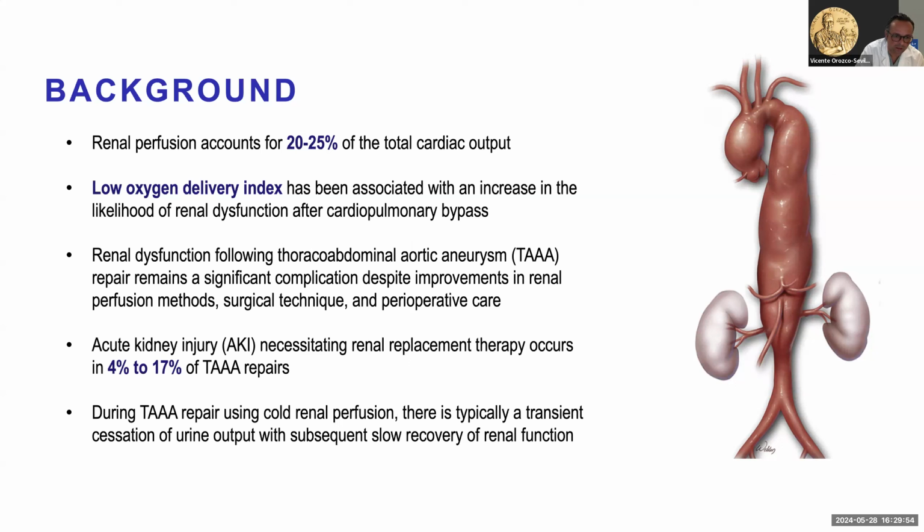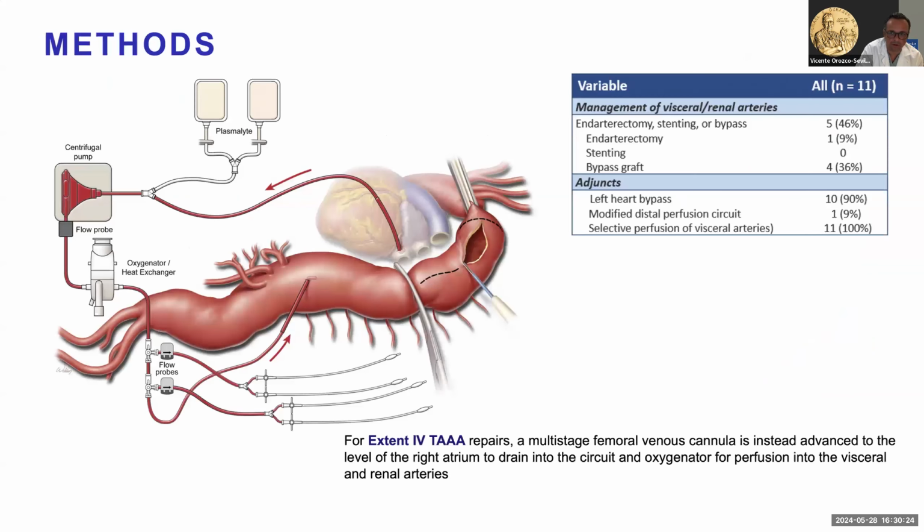We also observed that with cold renal perfusion, there was always a transient cessation of urinary output and slow recovery of renal function in the postoperative period. But with this technique, using pretty much the patient's own blood, loaded with oxygen, patients never stop making urine. If we're perfusing the kidney, the patient usually doesn't decrease his urinary output. So we are experimenting with this technique. We have a series of patients that Anna presented at the AATS, and there are not many, but there are more to come.